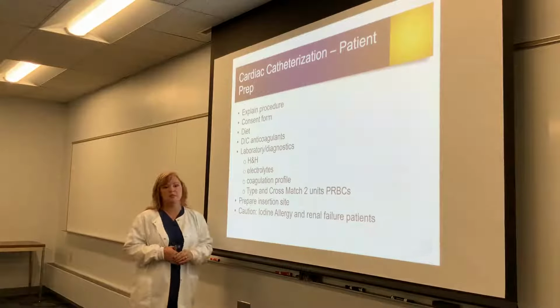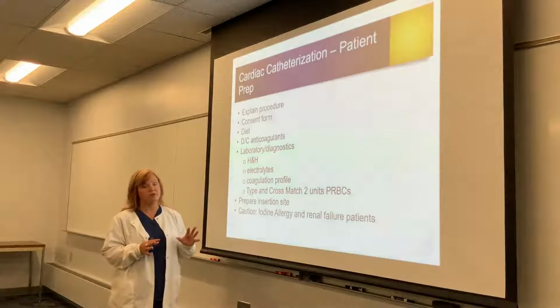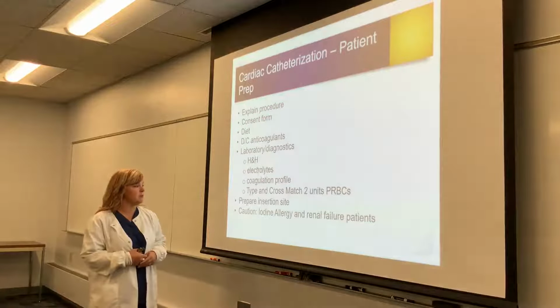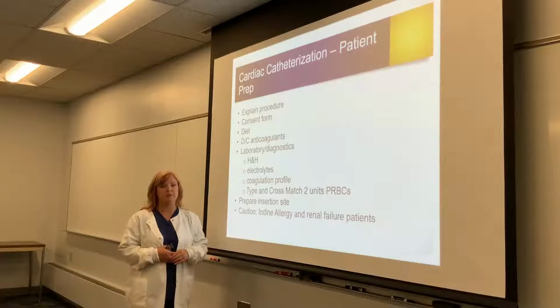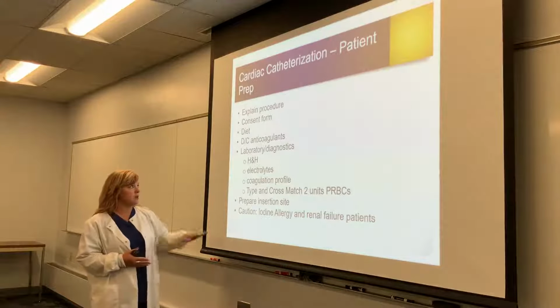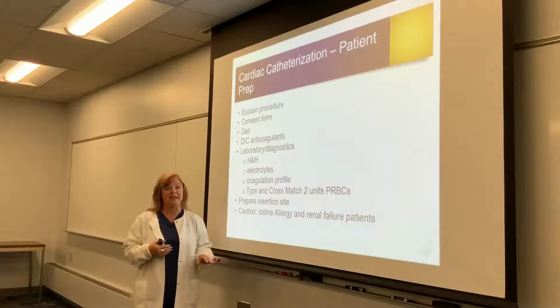Preparation of the site might be done in your pre-op area. It might be done actually in the cath lab, so it just depends on your site, but the site will be shaved and it will be prepped with typically iodine. But of course, if they have any type of iodine allergy, they might be using chlorhexidine or something else to clean the site. We do also need to worry about any allergies to iodine because of the dye that they get.